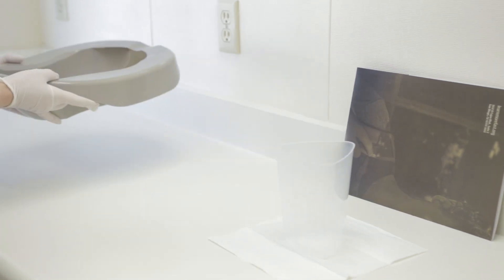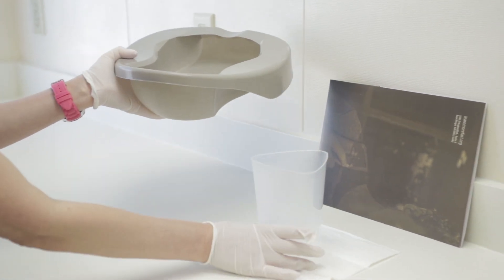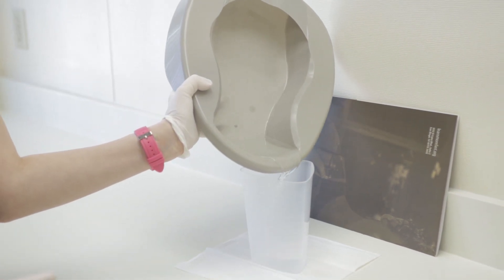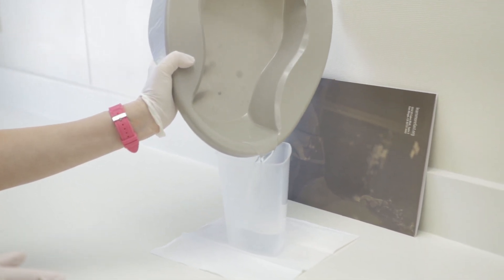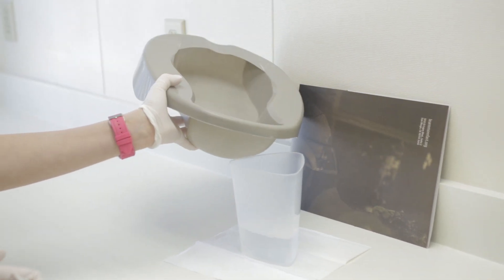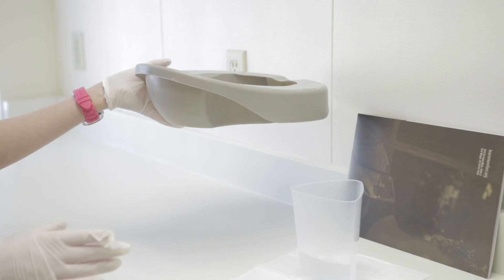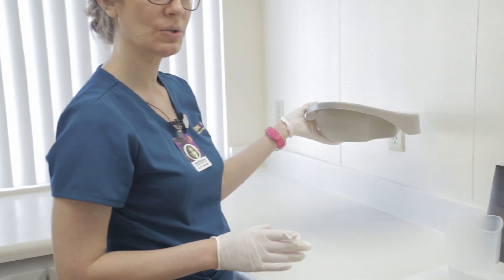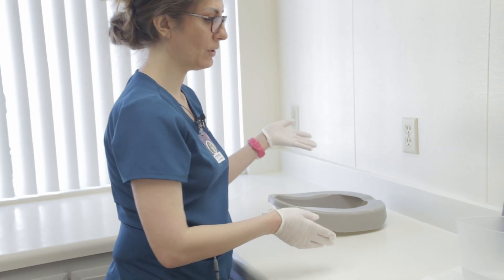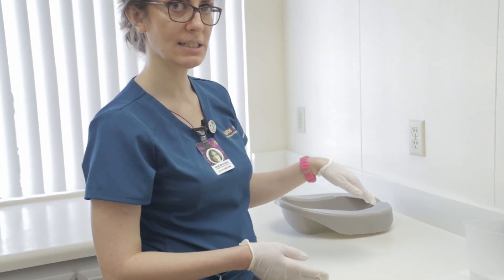Pour the urine inside the graduated cylinder without spilling or splashing. You can then rinse the bedpan and store it away. When you rinse, pour the contents inside the toilet.